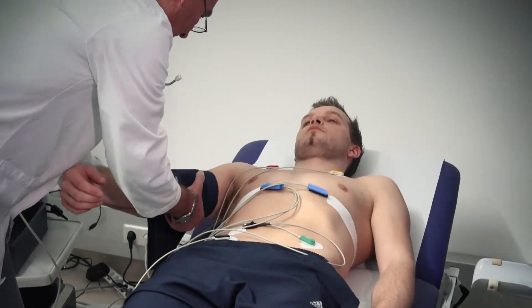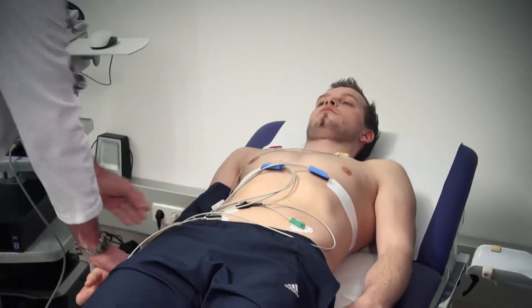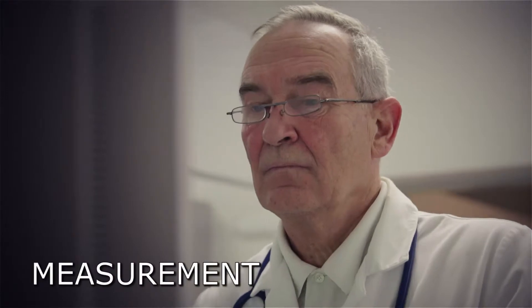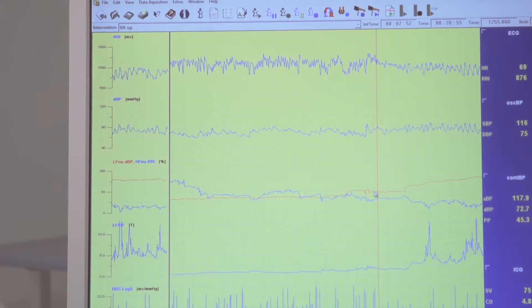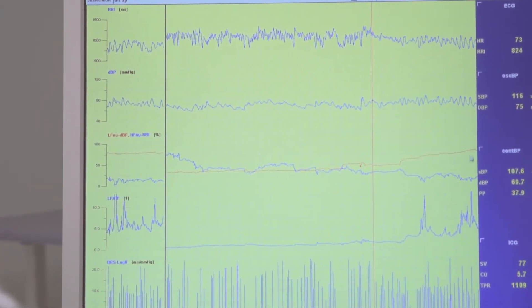The Task Force Monitor uses a traditional upper arm cuff for calibration at heart level. After the patient's setup, the Task Force Monitor software is started and patient ID, height, and weight are entered. A single mouse click starts the measurement.